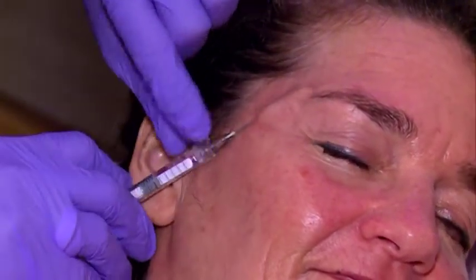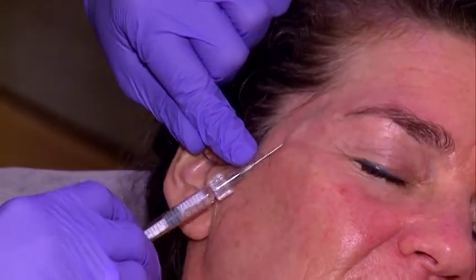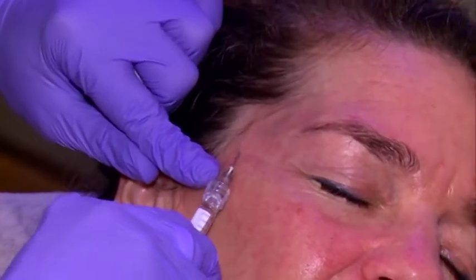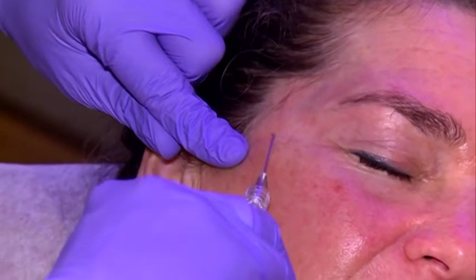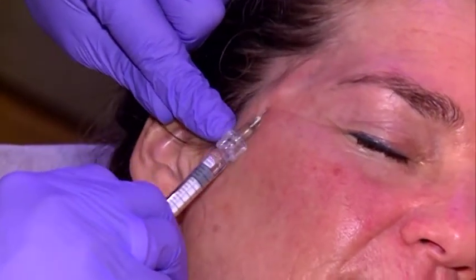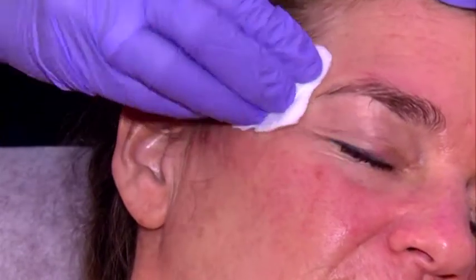And you can also do a little bit of lifting on the eyebrow, injecting more. So this is, again, really subcutaneous here, right under the skin. You see the material. If I would be too deep, if I would be under the fascia, you do not see the material at all. Would you agree? Nice. Very nice. And then I massage it. That's why I say this is a technique you can do easily with Bellotero volume. If you use, for example, Restylane, just to mention one product, this is more particulated, so the molding and massaging out in the subcutaneous tissue might not be as easy.